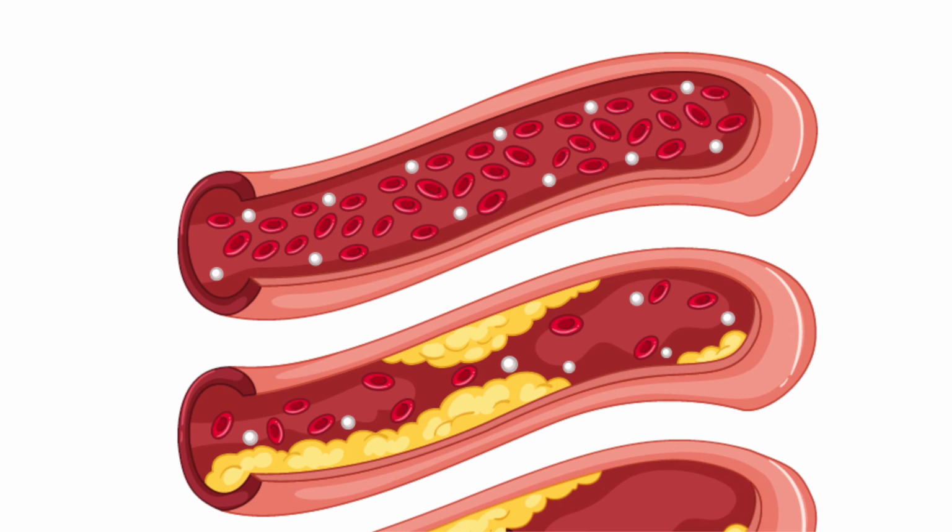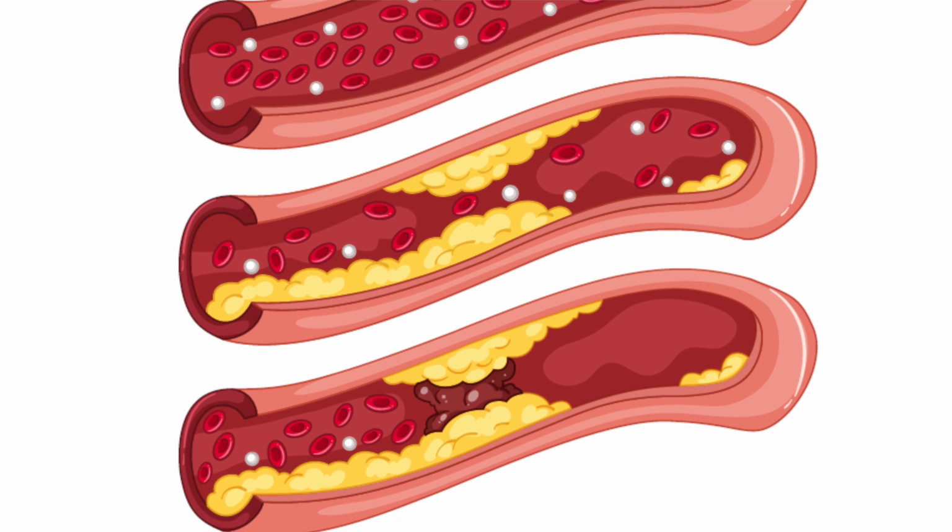Today we are going to discuss coronary angioplasty, what the procedure is and what we should know about it. Coronary angioplasty, also called a stenting procedure, is done to clear the blocks which have formed in your heart vessels. This procedure is advised for patients who complain of chest pain or breathing difficulty during exertion or at rest, and then an angiogram is done where the blocks in the blood vessels are confirmed.